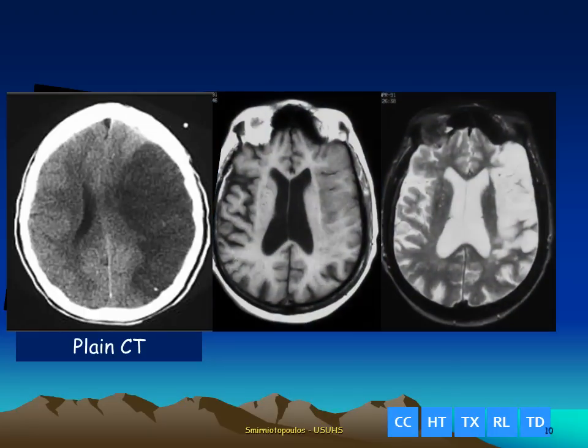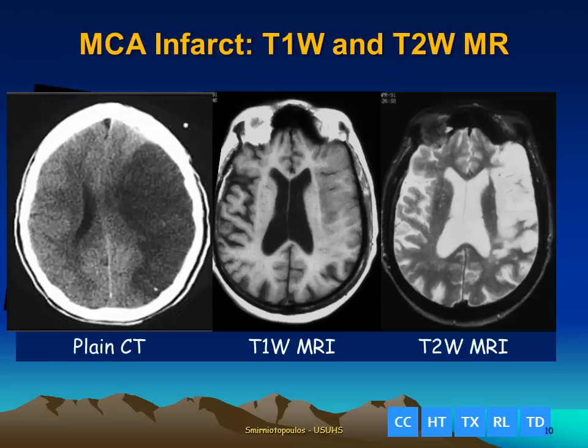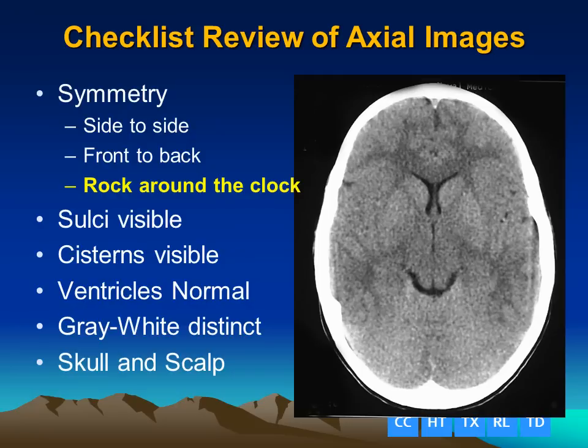For our last case, we have a patient who has abnormal attenuation and abnormal signal intensity of the cerebral cortex — abnormally low signal on the T1-weighted image, and abnormally high signal gray matter on the T2-weighted image. This is consistent with a large middle cerebral artery cerebral infarction.